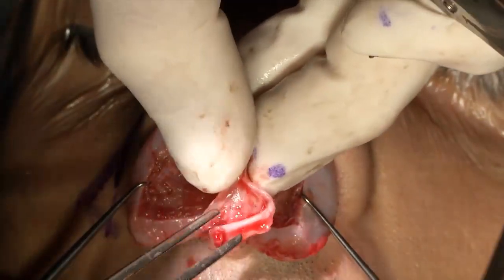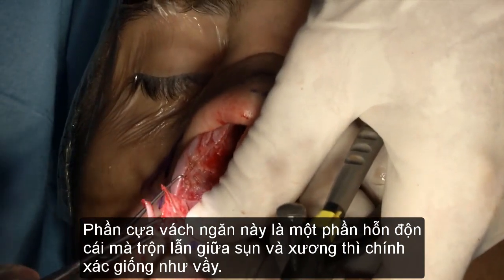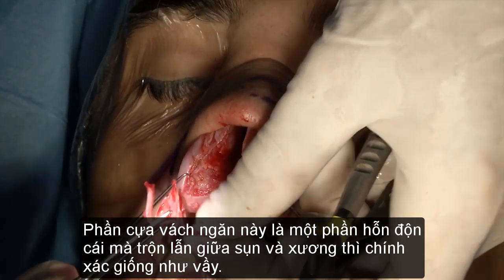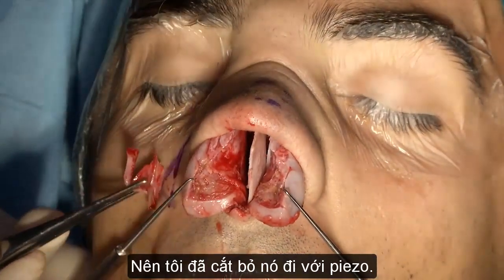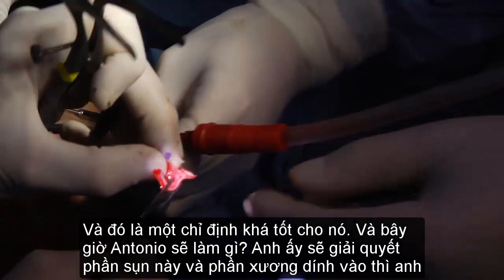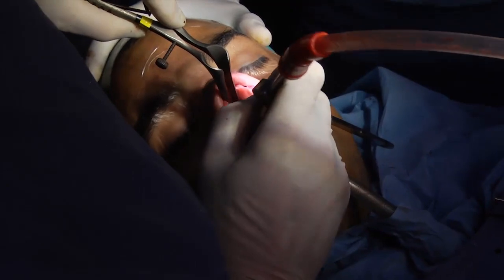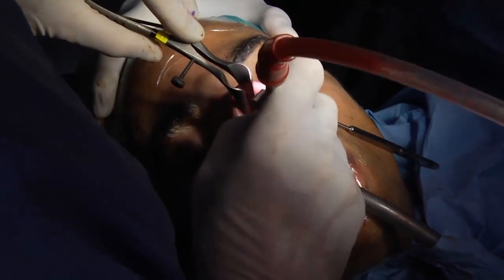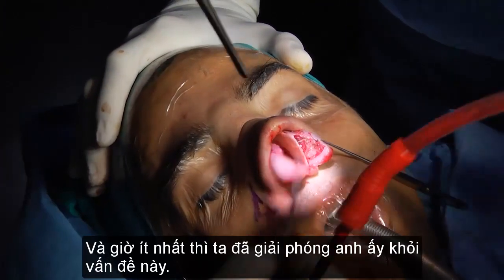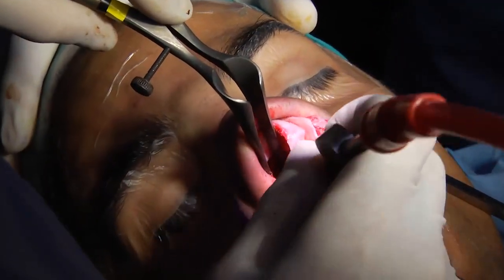So this septal spur, which is always a mixture of a little bit of cartilage and bone, was exactly like this. So I cut it with a piezo. And that's really a good indication for it. Now what Antonio will do, he will take care of this cartilage, and that bone he can throw away. So now I can tell you he's free of that problem, at least.